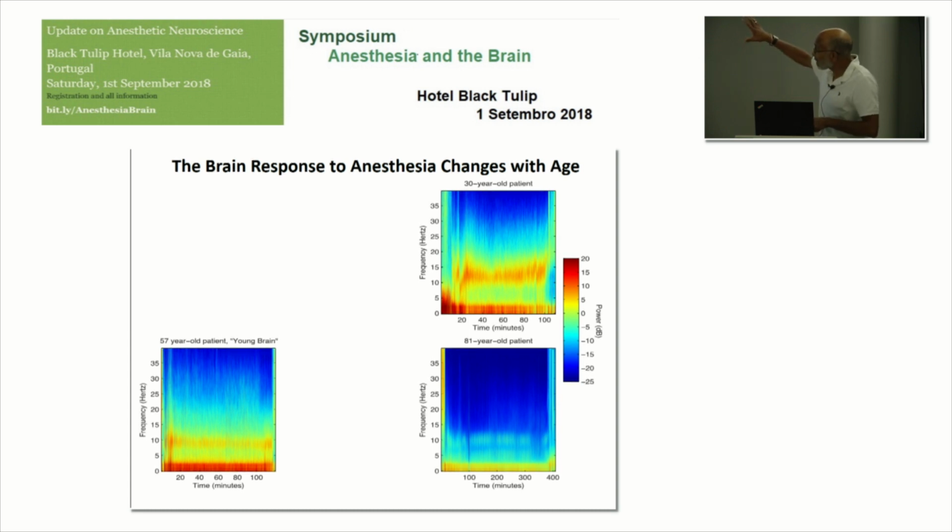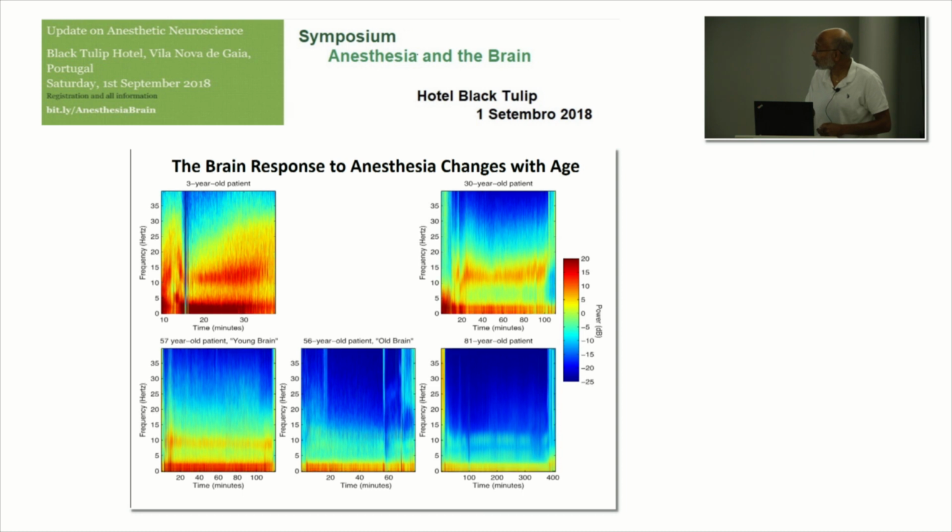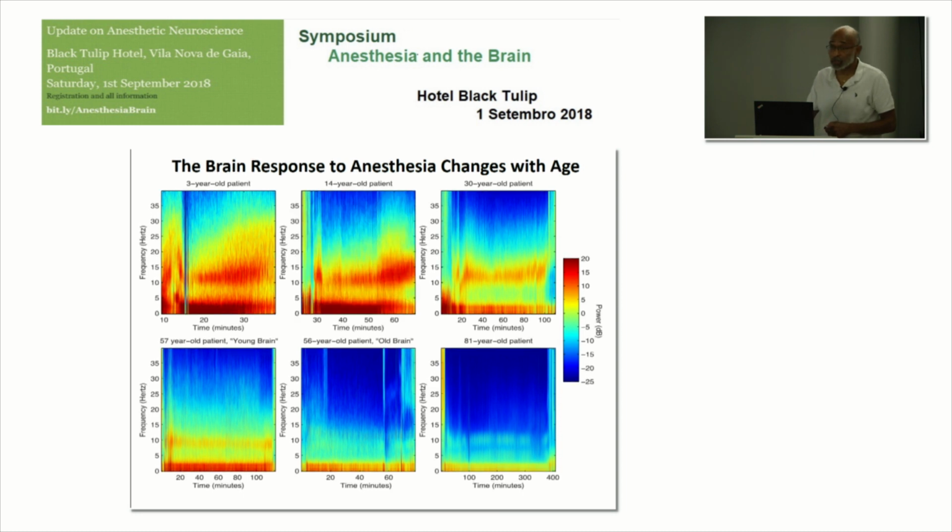And this idea of the oscillations losing power as we get older is very, very well known. And in fact, the rate at which you might lose power might be different for different people, in the sense that we are physically aged differently, our brains age differently as well. And you can actually see that here. If you look, here are the kids. This is someone who's 3 years old, and this is someone who's 14 years old. So you can see you have roughly the same dynamic. But if you generate a naive algorithm to measure depth of anesthesia, and you build it on people in these categories here, then you can see exactly why it wouldn't work on very young people, or it could give you misleading information in people who are older.